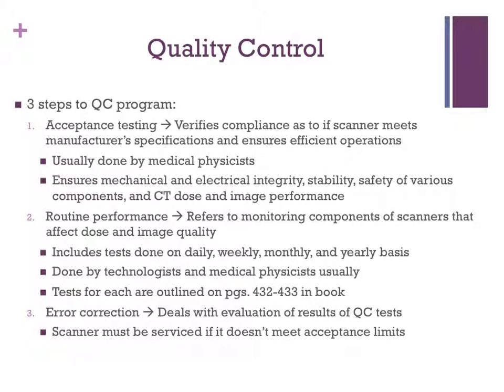The acceptance testing is usually done by medical physicists, and it ensures that the scanner has mechanical and electrical integrity, stability, safety of various components, and CT dose and imaging performance. Examples of acceptance testing could include verification of slice thickness, CT uniformity, CT number linearity, spatial and contrast resolution, noise, and dose output.